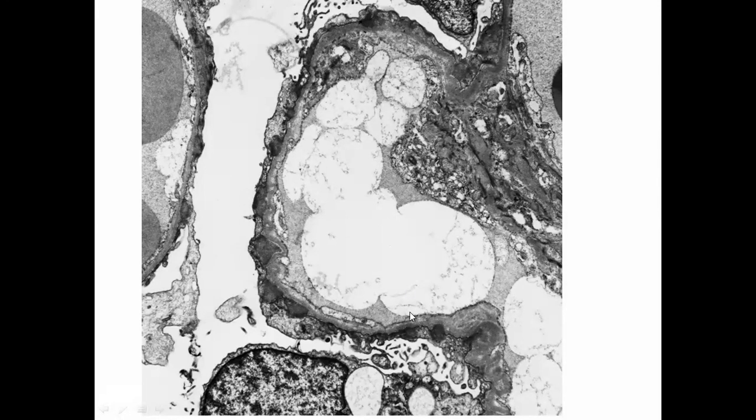The second thing you look for is whether these electron dense deposits are also seen inside the glomerular capillary loop, which we are not seeing here. Those would be labeled as subendothelial deposits. So in this photomicrograph, what you can see is the presence of these subepithelial deposits.